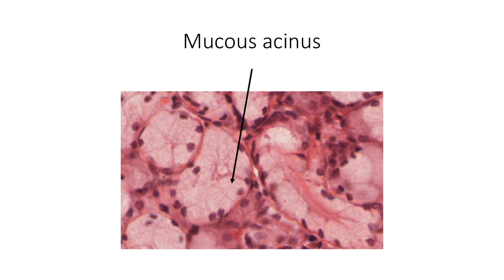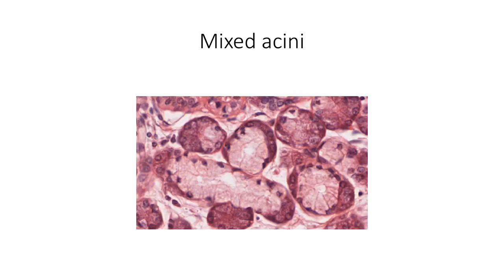Mixed acini are lined by both serous and mucous cells. Although both types of cells are arranged side by side in the acinus, routine fixation methods used while preparing H&E sections result in swelling of the secretory granules of the mucous cells, which pushes the serous cells to the periphery so that they appear as crescent-shaped serous demilunes. This is a fixation artifact, but this appearance of a mucous acinus with a serous demilune is the classical appearance of a mixed acinus in an H&E stained section.